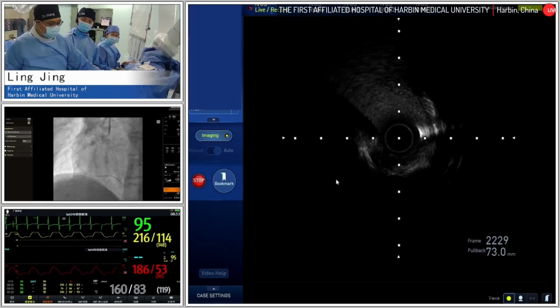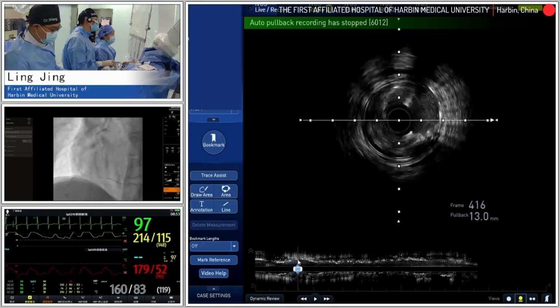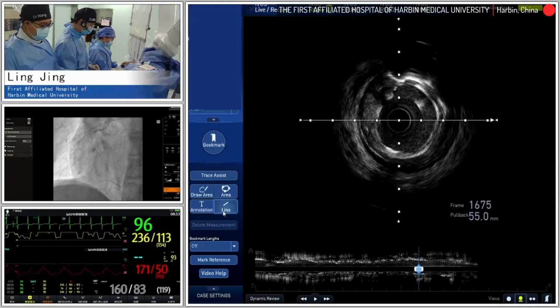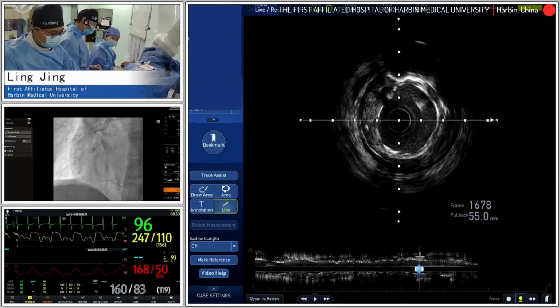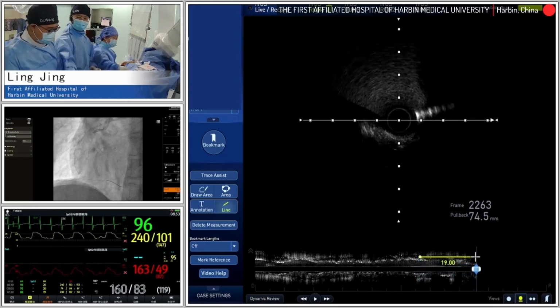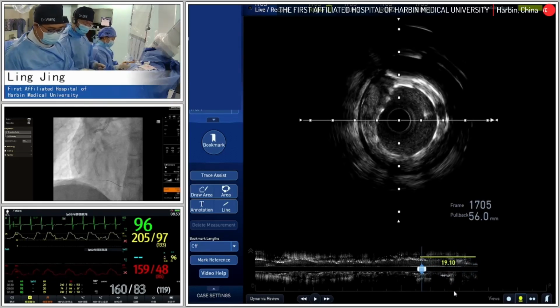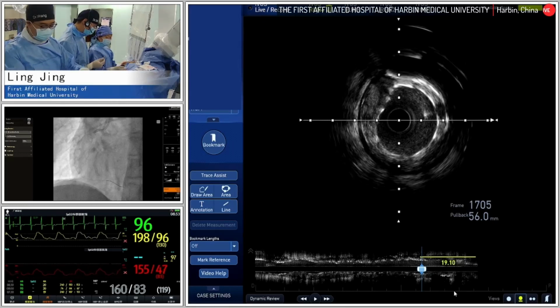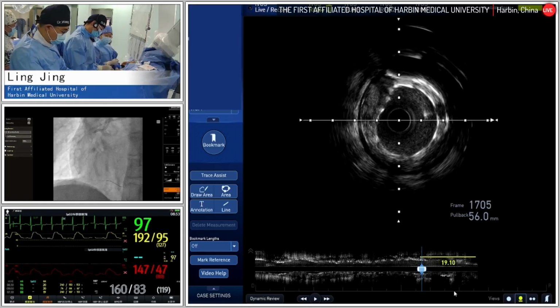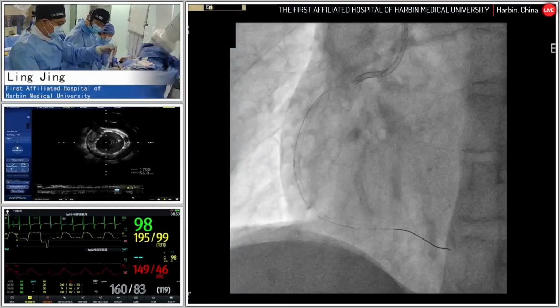I think we need one more stent after the NC balloon dilation. So let's measure the third stent length. I think it's going to be a 3.0 stent. So let's see the length. 3.0, how long? I think 18, 19, or 20 is fine. 20 maybe. 3.0 by 20. So maybe we post-dilate first and then put the third stent. First, NC balloon, so maybe we'll perform NC balloon dilation first to see the situation.